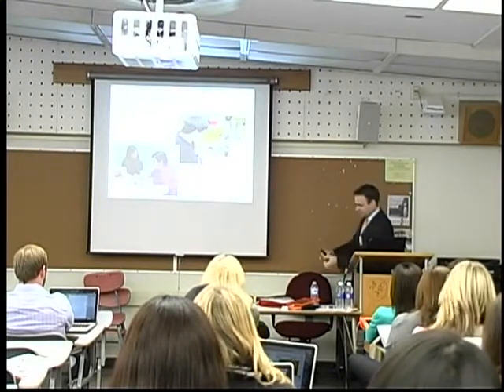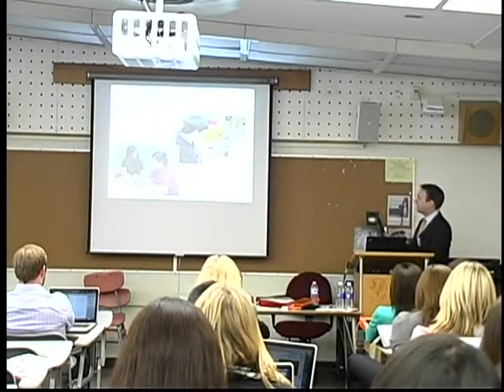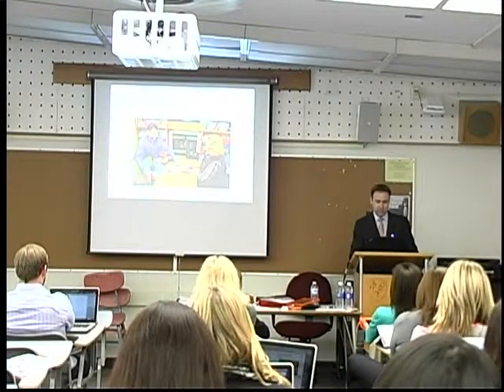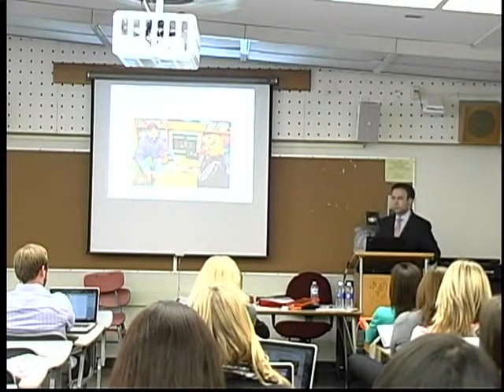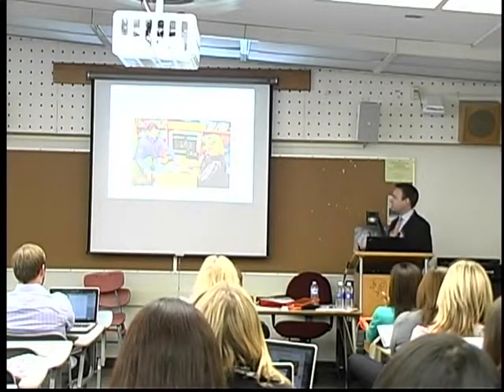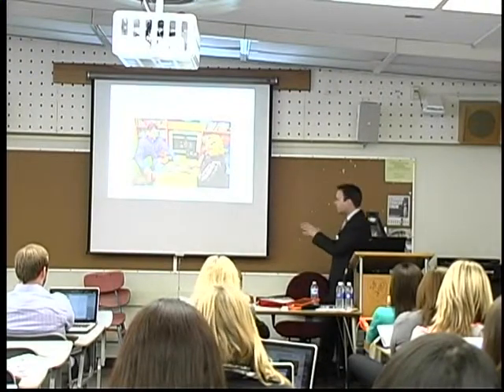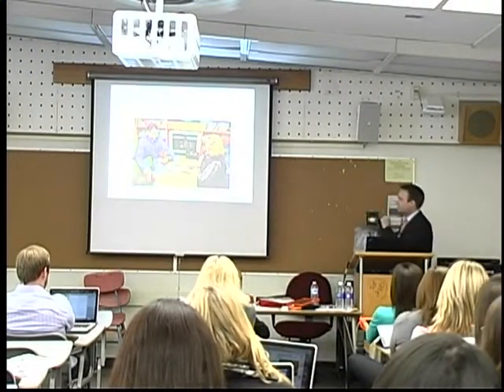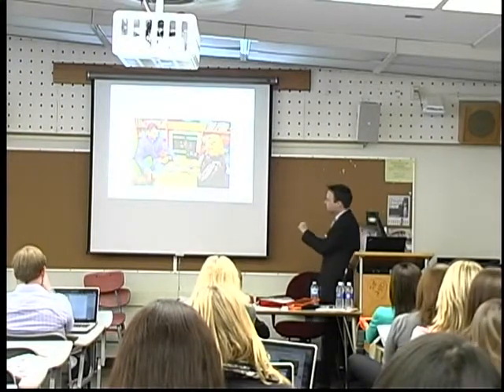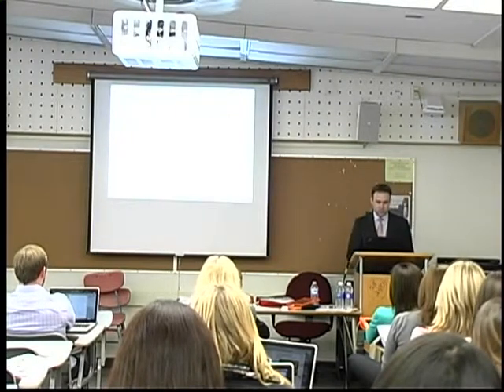It can incorporate all types of graphic symbols or photographs that you take with the iPad, and it can be used with children as well as with adolescents and adults. And we have been able to demonstrate that parents can be involved in intervention, and this is so easy to use that parents can be trained, at least in the beginning stages. Later on, they should get a good amount of supervision, but in the beginning stages, parents can be the interventionist and get some initial communication going with SpeakAll.